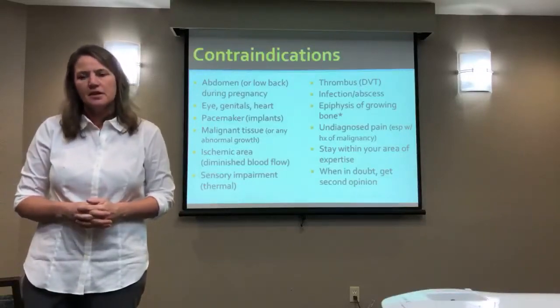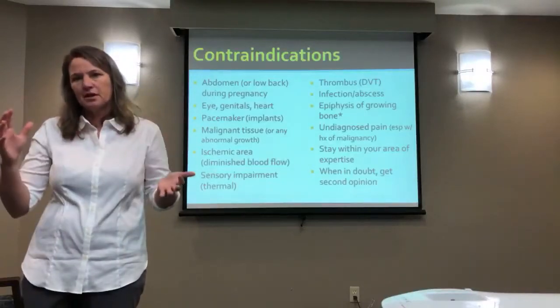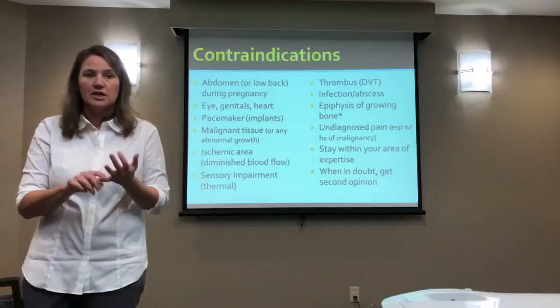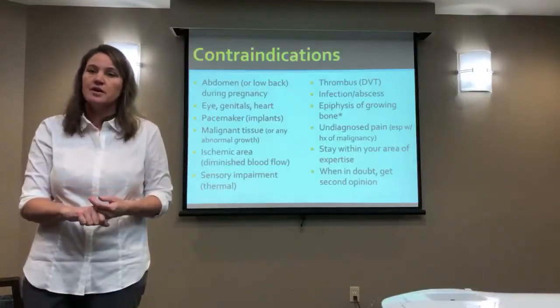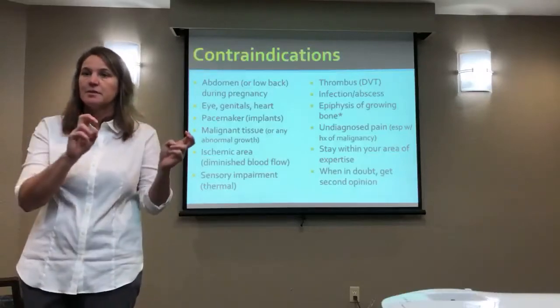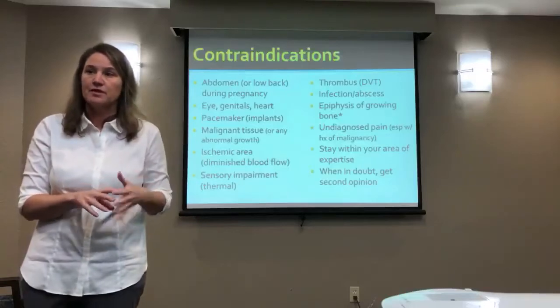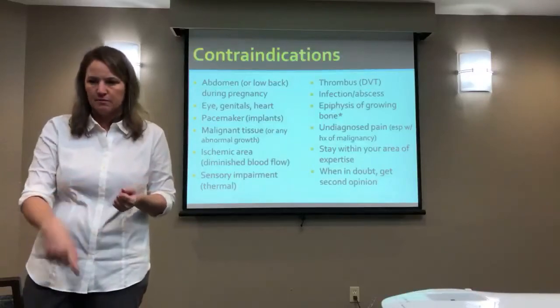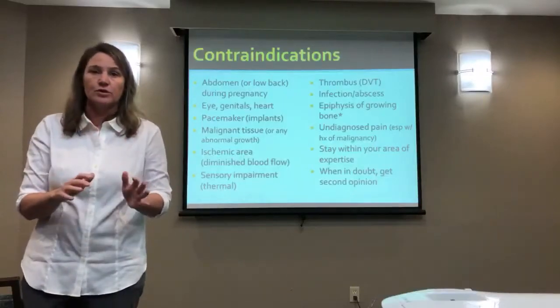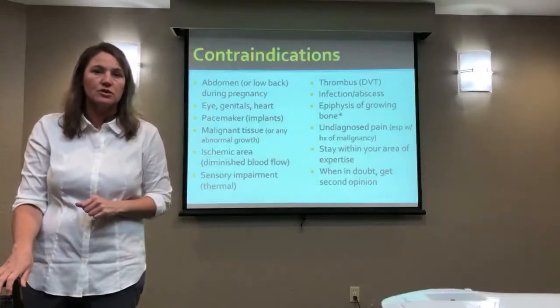In an ischemic area, the worse the blood flow is, the less predictable it becomes what ultrasound is going to do when it encounters this tissue. So it could heat up faster, it could cause harm. So I wouldn't do any ultrasound, even on the settings that are designed to be non-thermal. I wouldn't do any if they have very impaired blood flow. So again, back to the idea of the black toe and the tissue around the area, it has such impaired blood flow, you don't want to do anything that could harm it.